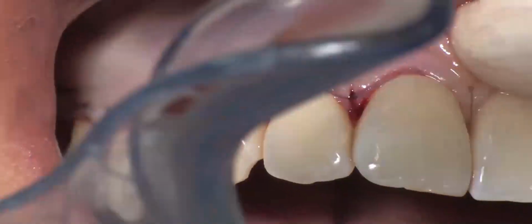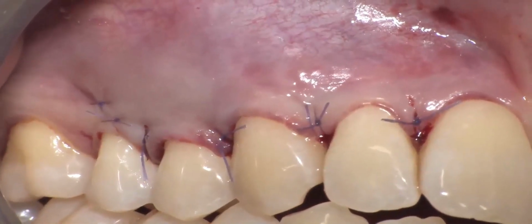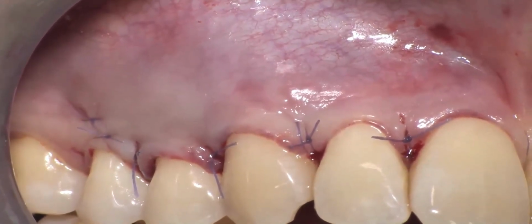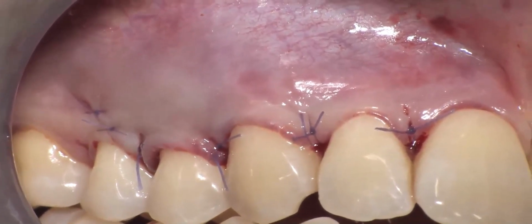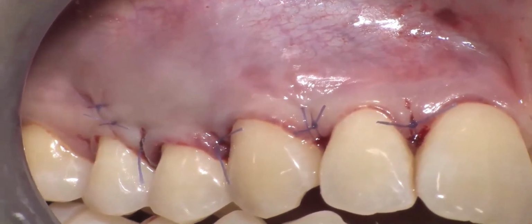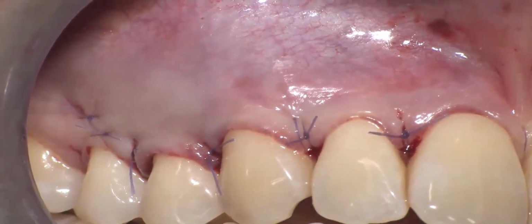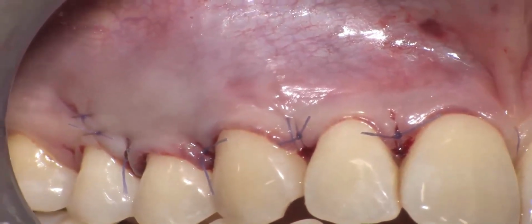Now I will show you the picture of the area. You see the difference between the volume of the soft tissue at the level of the lateral, where no material was placed, with respect to the canine and the premolar, where there was the adjunct of the material. But in terms of marginal stability, there is no blood escaping from the soft tissue margin in any of the treated teeth.